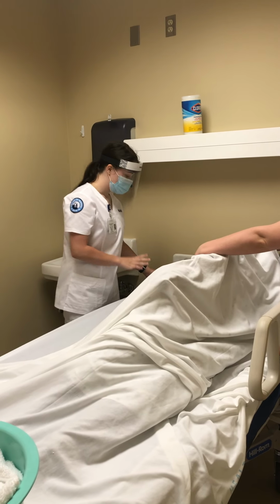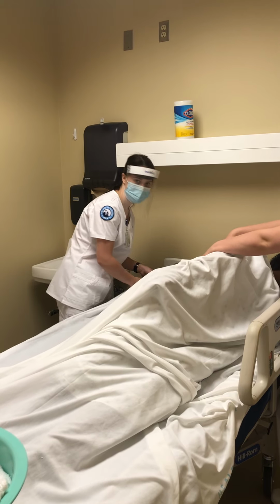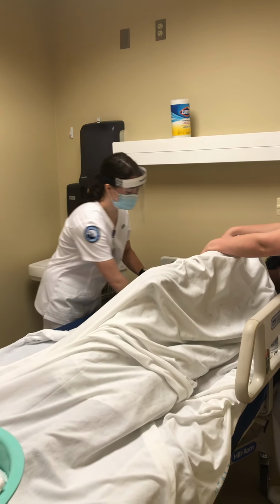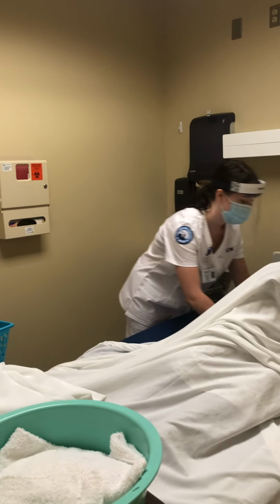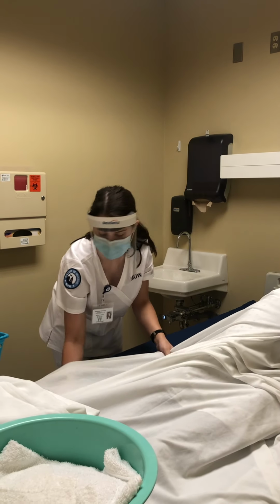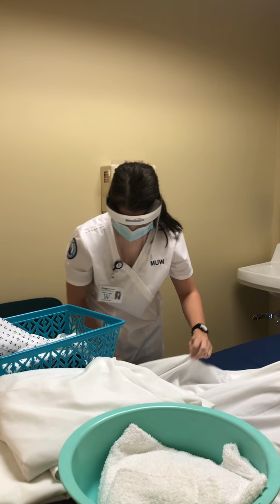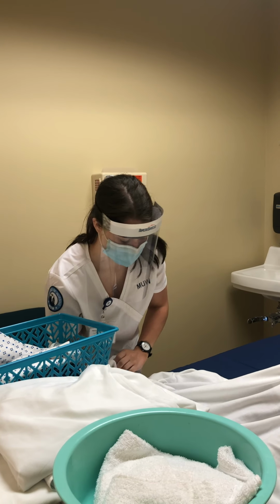I'm going to begin by removing the dirty bed linen, rolling it under as close as I can to the patient's back, always keeping her covered to ensure privacy. I'm going to continue rolling at that side.